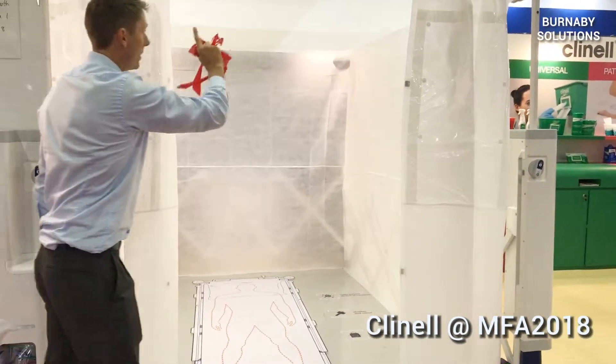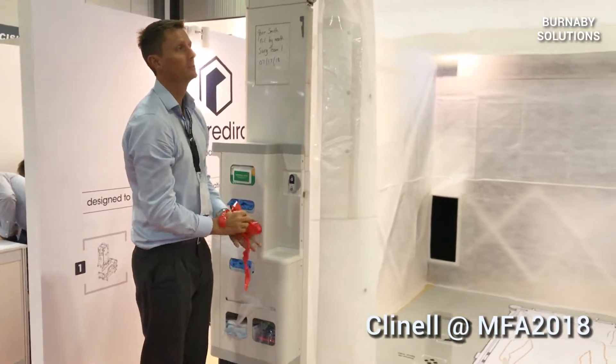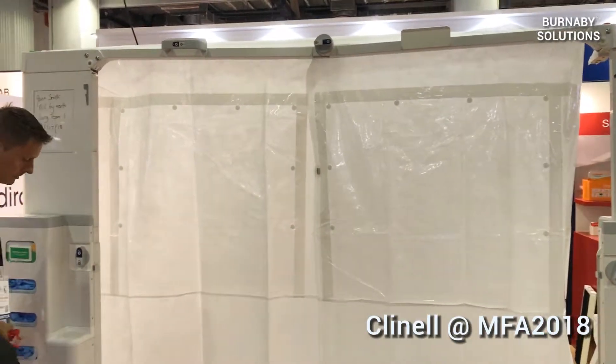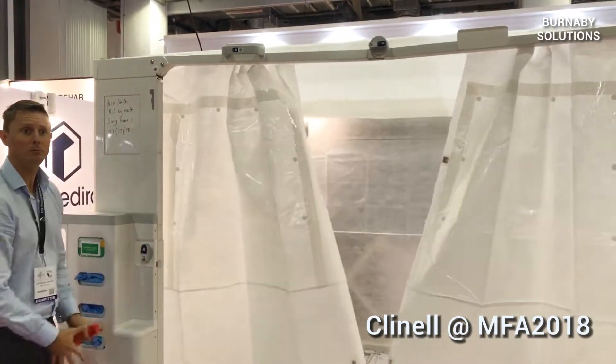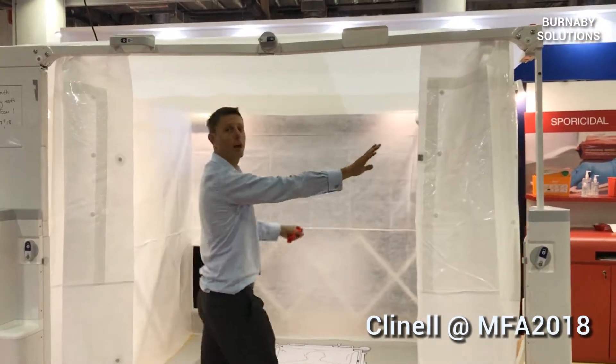Now I'm going to close the curtain — it's actually going to open. That all should close by itself. And now I can hand spring open and close. If I need to observe the patient, I have curtains.